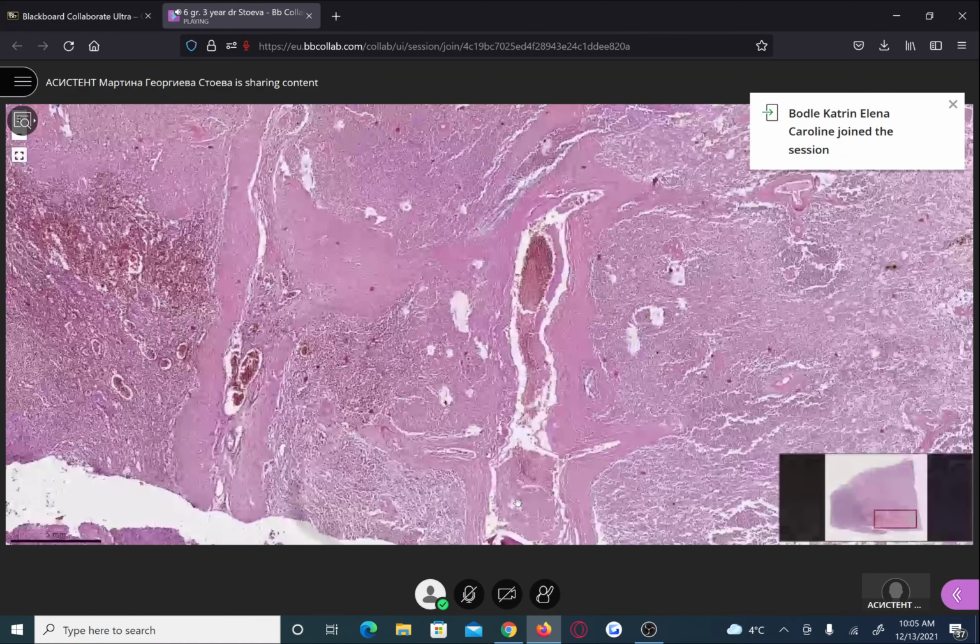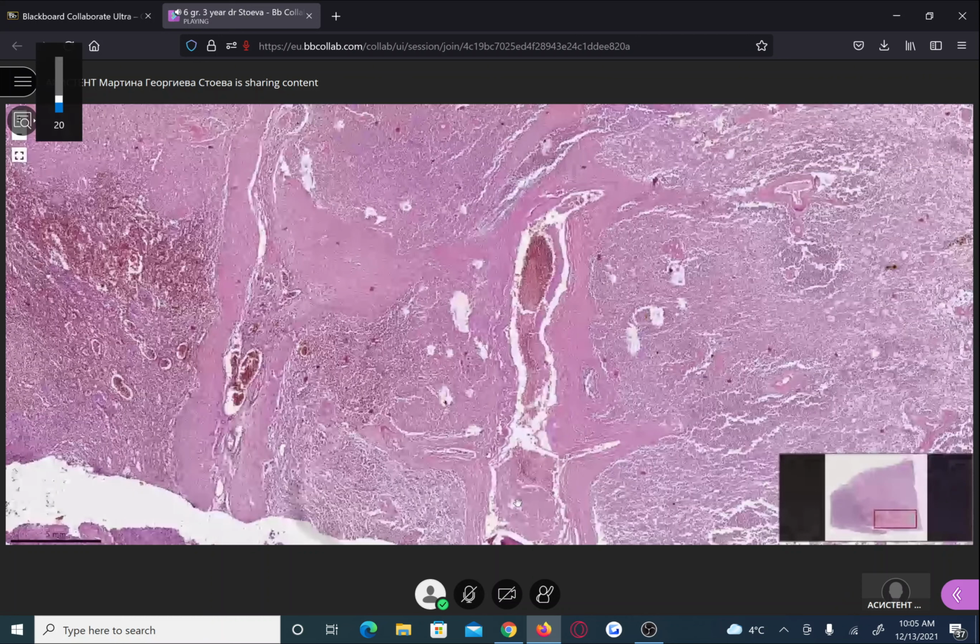In this case, the special staining that is in the lumen of the artery, it will mean that this is a thrombus or an embolus, thromboembolus, which comes from a thrombus formed in another site, and then this will be the cause for infarction.